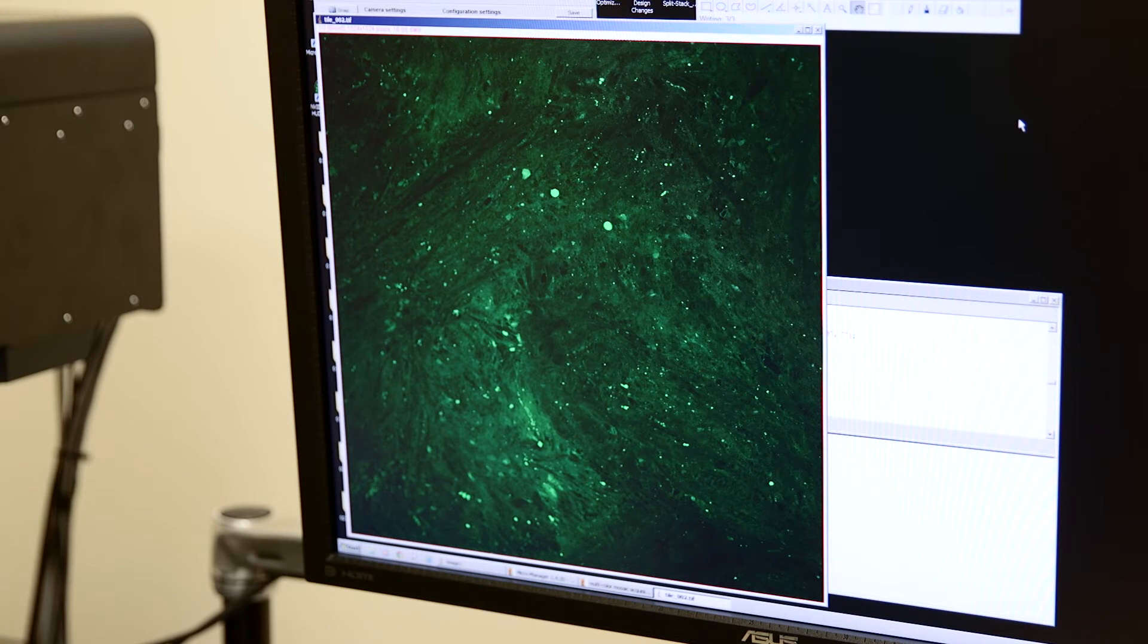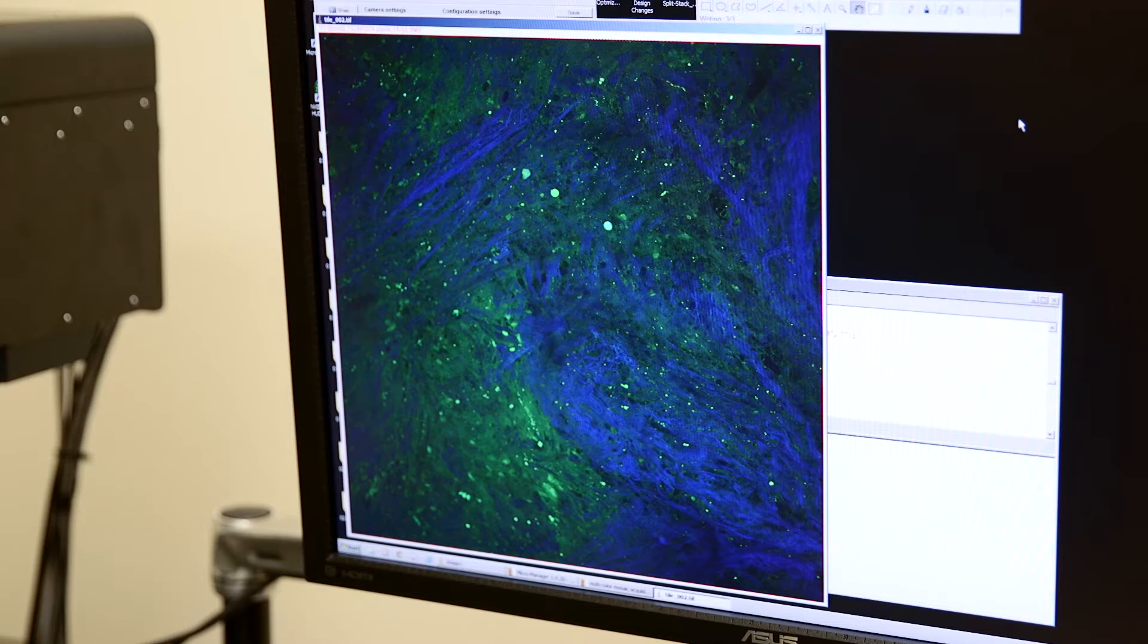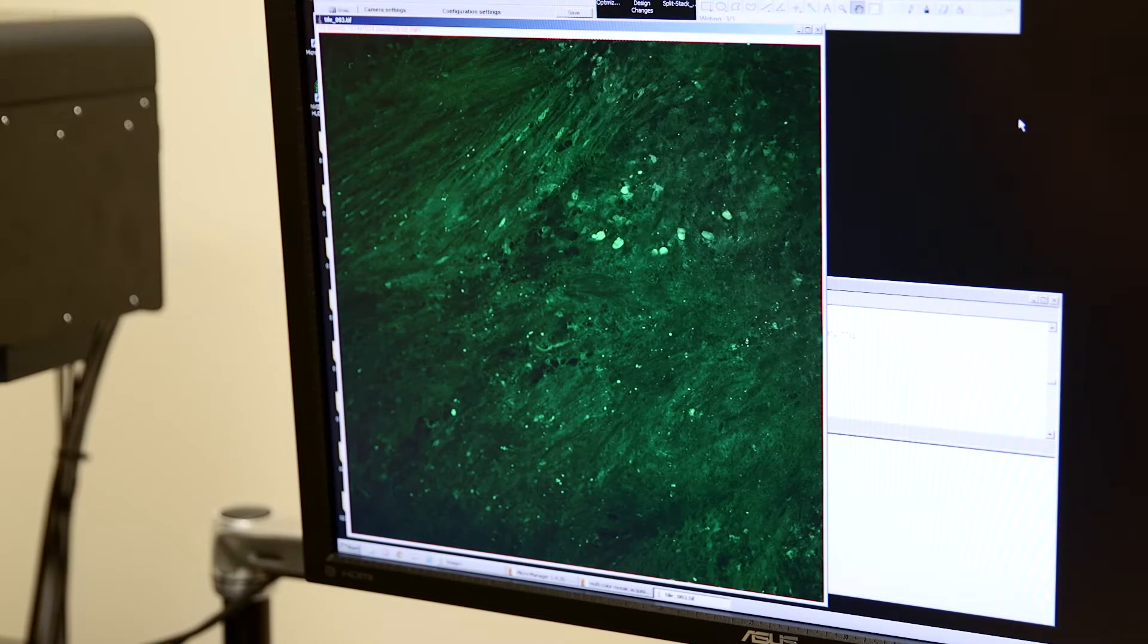Generally what you see here is in green is lipid-rich structures. What's in blue is protein-rich structures so we can actually use that lipid protein ratio to see cells in the tissue and it allows us to differentiate between normal tissue which is much less cellular and tumor infiltrated tissue which contains a lot of tumor cells.